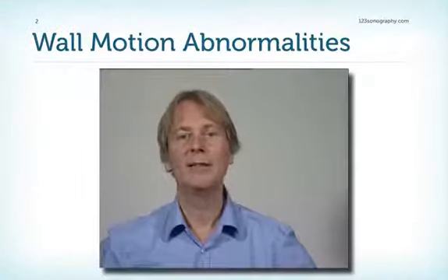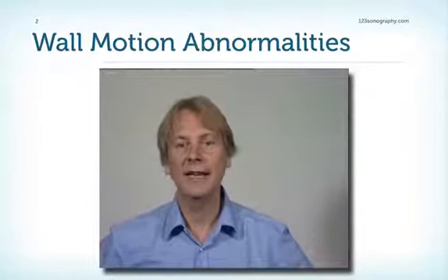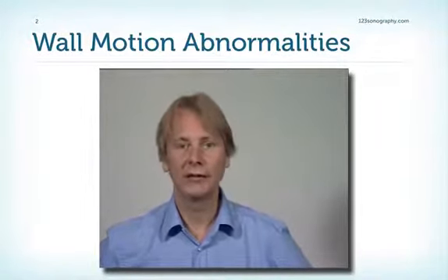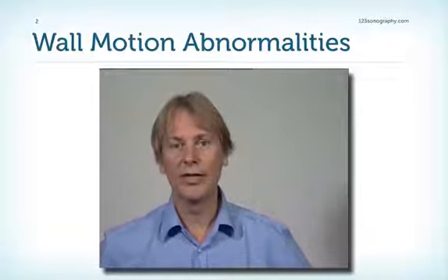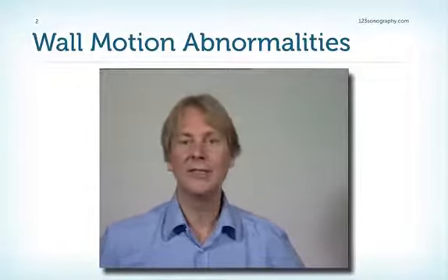I still remember way at the beginning of my times in echocardiography when I was still learning, I was always attending my professor when he was reviewing studies. And he would be doing that from a video recording. At that time we did not have digital echocardiography. And he would be sitting there and doing these studies in fast-forward mode. And he would make diagnoses like hypokinesia or akinesia in even small segments.